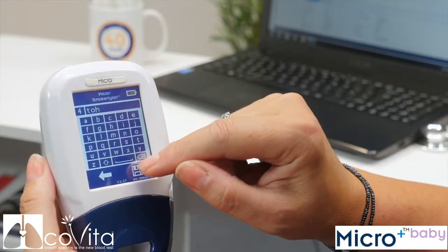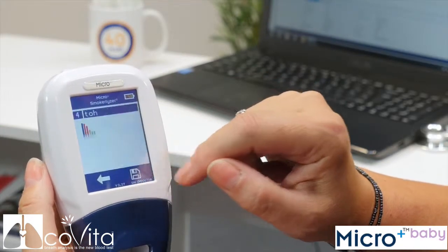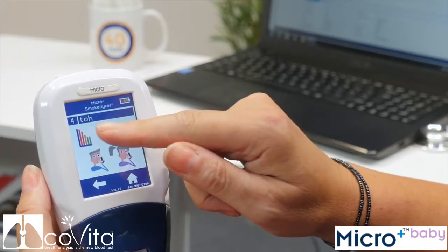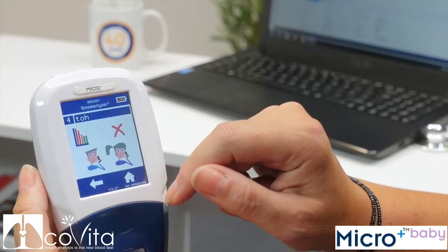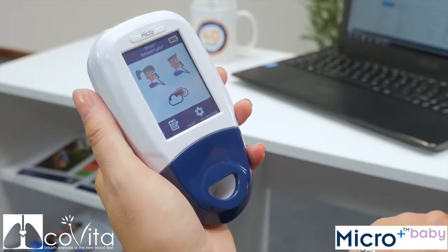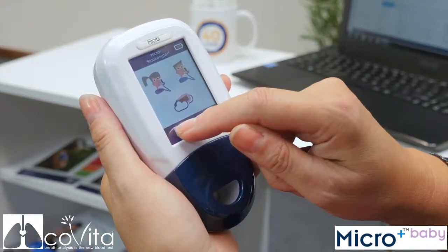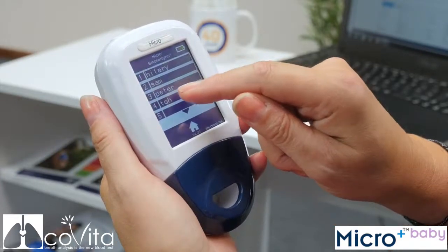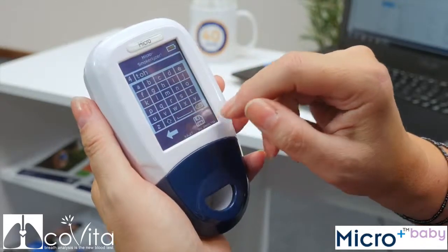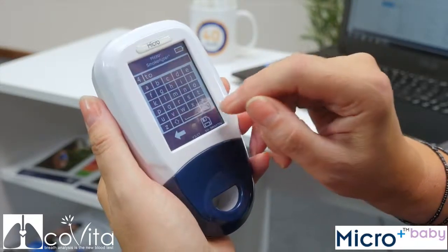Once you've entered this, click the Save icon to register the changes. You will now be able to see a graph of the patient's saved results. To edit an existing patient, click on the register and then select the patient you wish to modify. To change their name, click on their name at the top of the screen and use the keypad to edit.